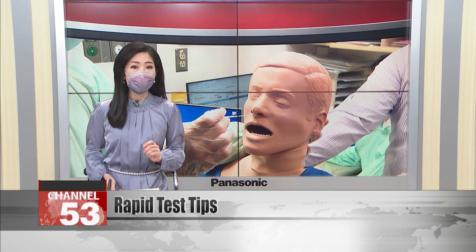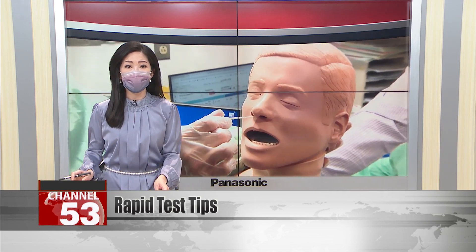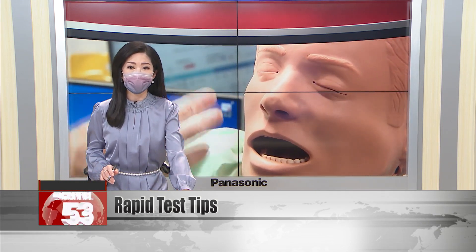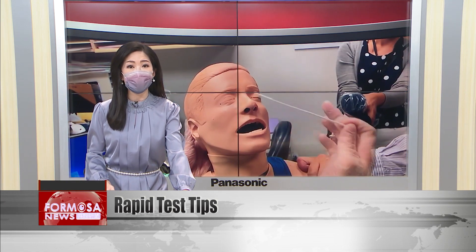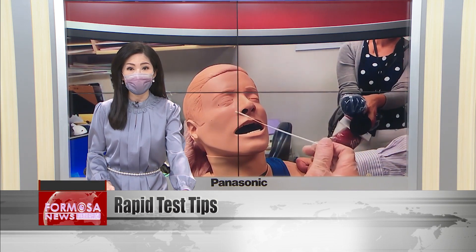According to Dr. Liu Pengchi, test swabs should be inserted much deeper than indicated in most instructions, which call for a depth of 2.5 centimeters. Dr. Liu said that's not deep enough to reach the mucus membrane and collect a sample.